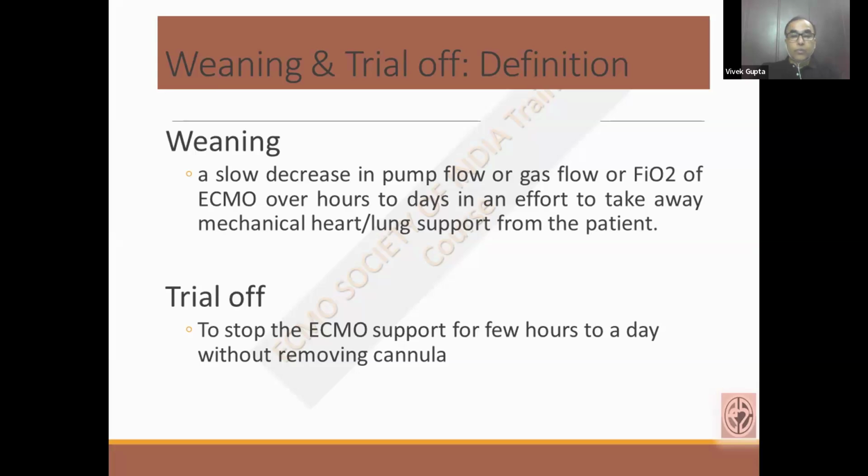While in the trial off, without decannulating, without disconnecting the ECMO circuit from the patient, we completely dissociate the patient from the ECMO support. So though there is no ECMO support, the patient is still connected to the ECMO, and if our trial fails, we can immediately resume the ECMO without any complication to the patient.